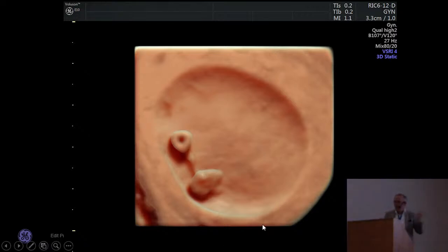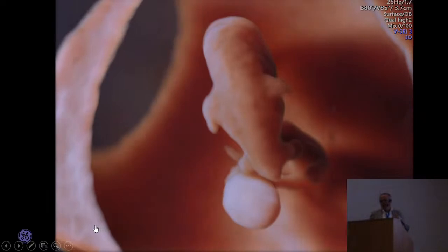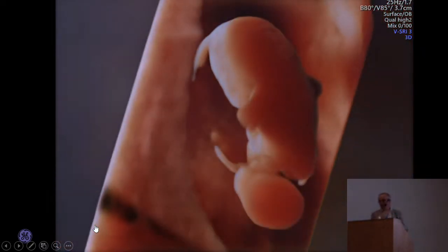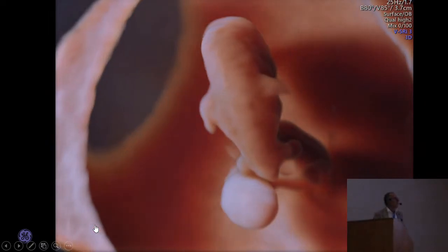And then we teach you also how to do the Cine calculation. So yeah, it's very impressive. I think especially in your field, because it's so emotional when the pregnancy, and just be sure that you just make a sweep and then get familiar how to make these images.